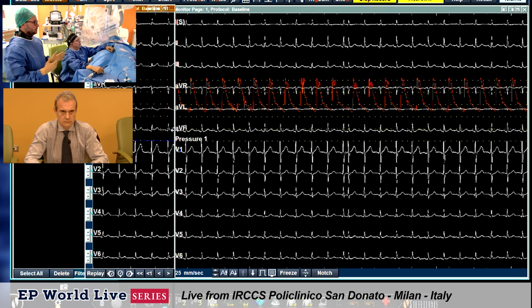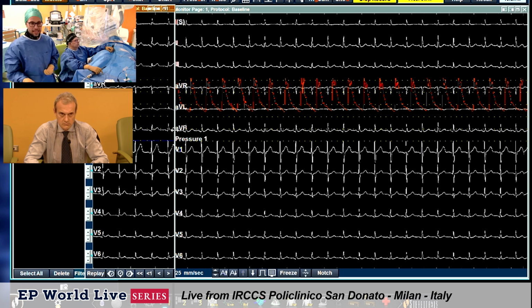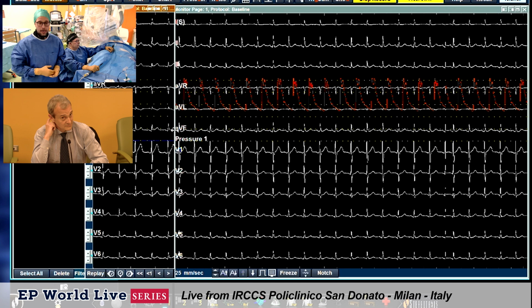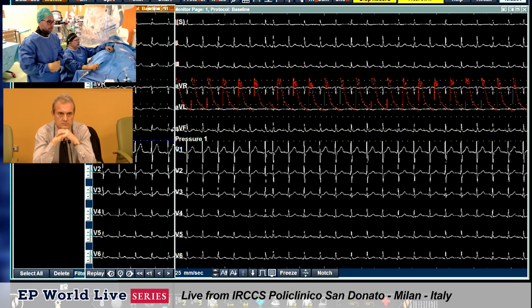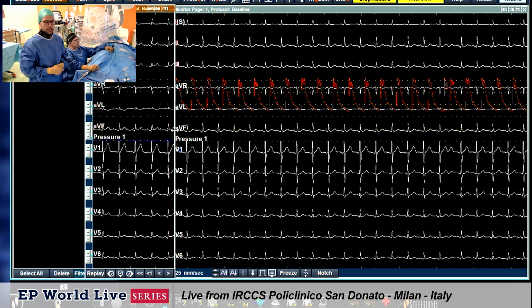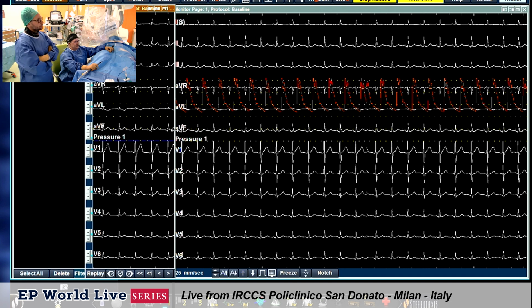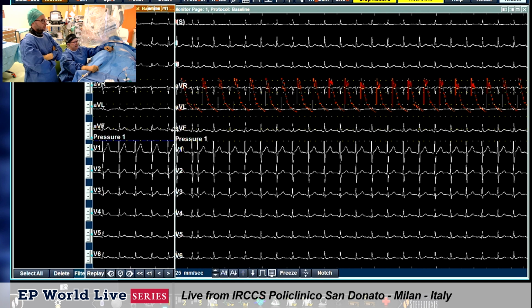It's not part of this procedure to perform ablation of early repolarization. Ajmaline is not necessary. However, it is necessary in the diagnostic phase, because a patient like this may hide a Brugada syndrome as well. So it is important to exclude this coexistence. But I think we can do it today. Yes, no problem. We can do it at the end of the procedure, after having dealt with the arrhythmogenic substrate, to show the results and that there is no overlapping condition. But we know the patient is not Brugada because we prepared this case during the ajmaline test.